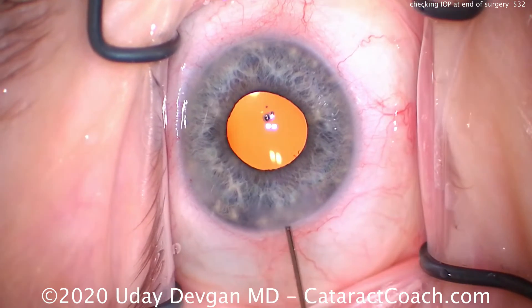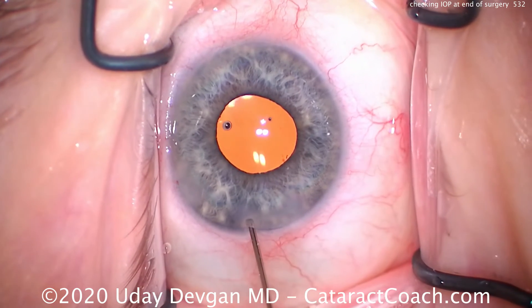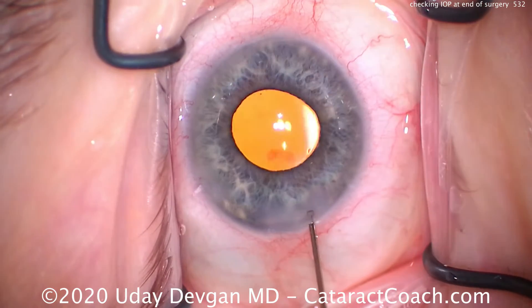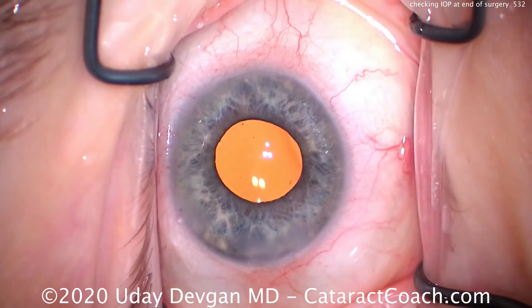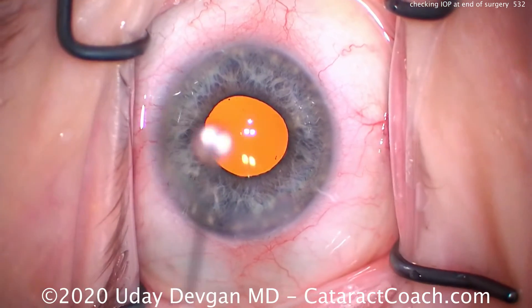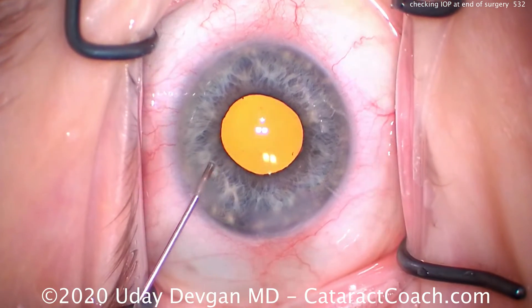We're sealing up the incision here, using a 27-gauge cannula filled with balanced salt solution, doing a little hydration right in the corneal stroma. That's sufficient. We don't want to do too much hydration — just enough to seal the incision. We don't want to induce any astigmatism from that.